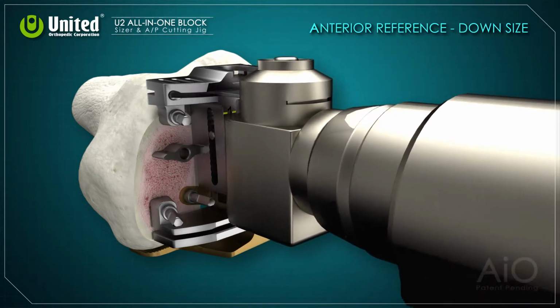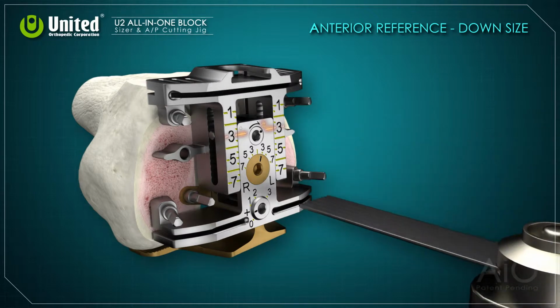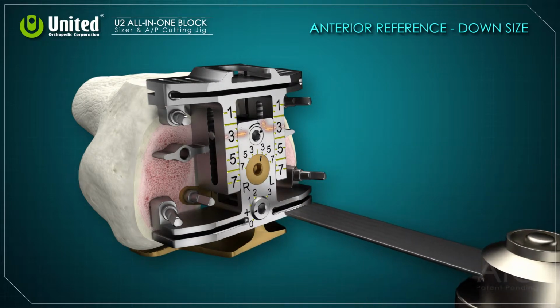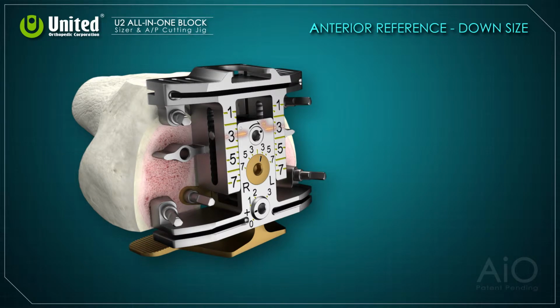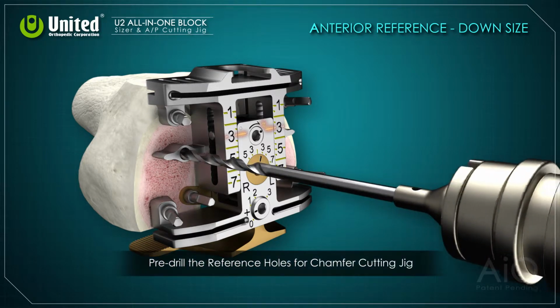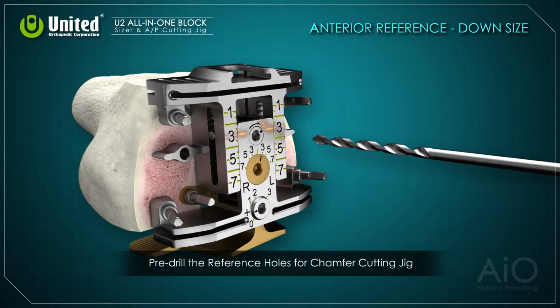Then, finish the anterior and posterior cuts by using a 1.27mm saw blade. To reduce oscillation displacement, a narrow saw blade is recommended. Drill 2 reference holes for the chamfer cutting jig before removing the all-in-one block.